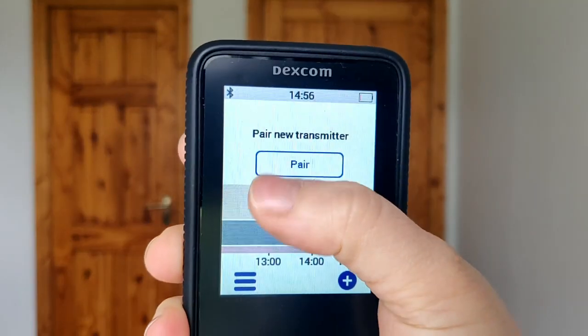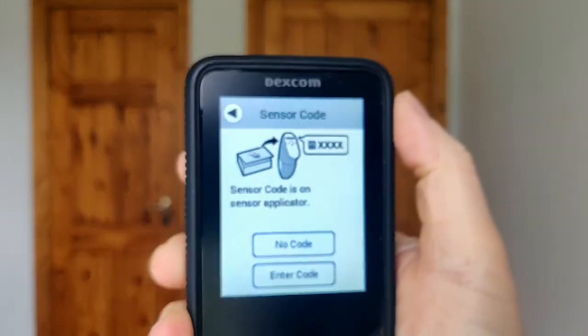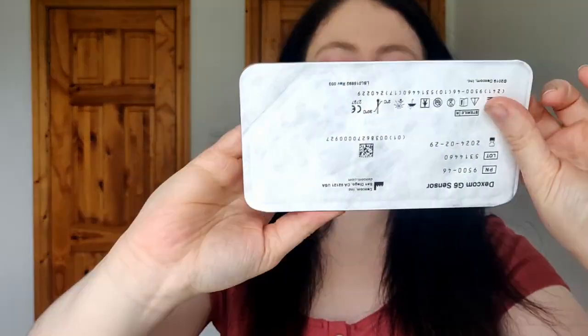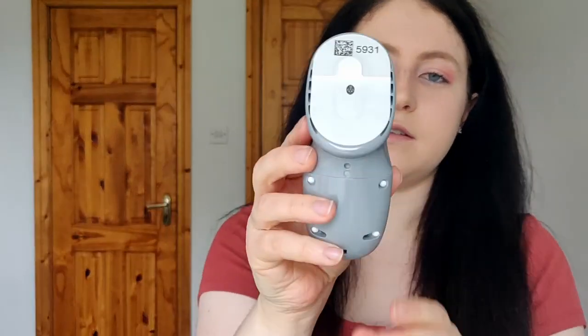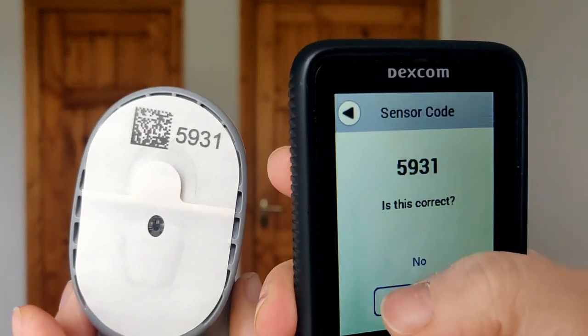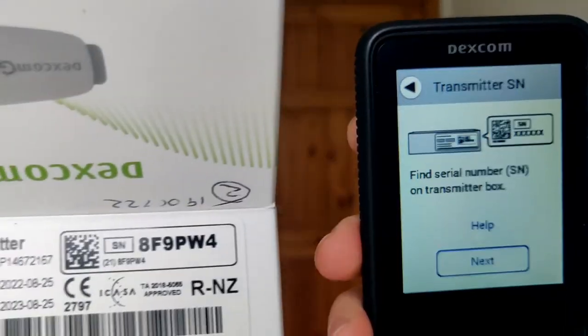The receiver is telling us we need to pair a new transmitter because the other one ended. We press 'Pair.' First we need to put in our sensor and sensor code, then we'll pair the new transmitter. Here is my Dexcom G6 sensor — I'll open it up. It has the applicator and the sensor code. My sensor code today is 5931. I enter that into the receiver, confirm it's correct, and it says sensor is successfully paired.